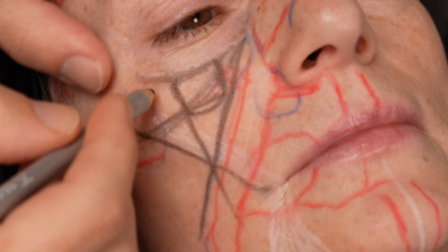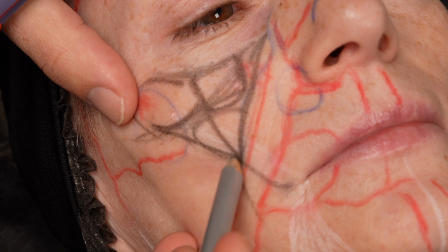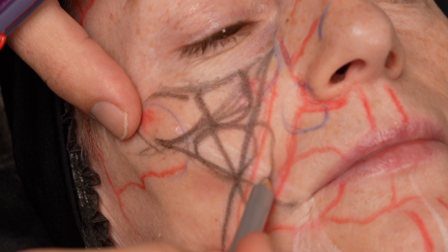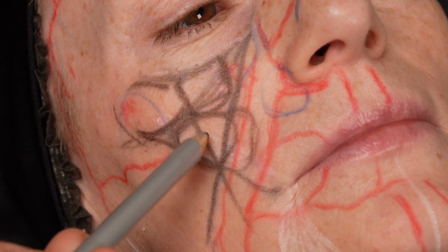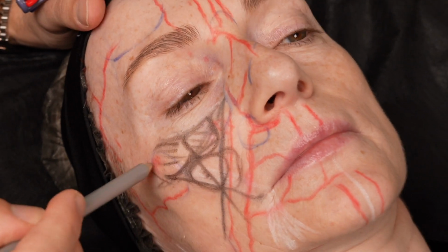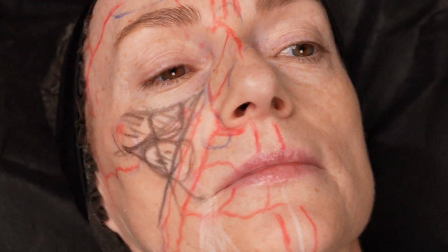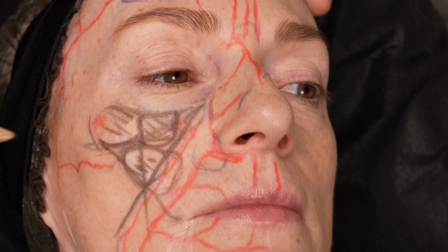Here is the medial SOOF, here is the lateral SOOF, and approximately the junction, because it goes like this, it has the medial part, but here is the deep medial cheek fat pad. Here, medial, lateral, and the junction. Okay? These are my 3 deep fat pads.